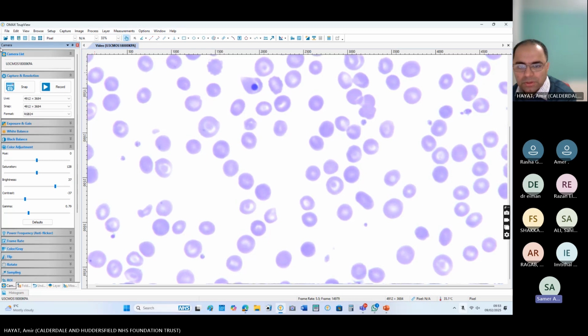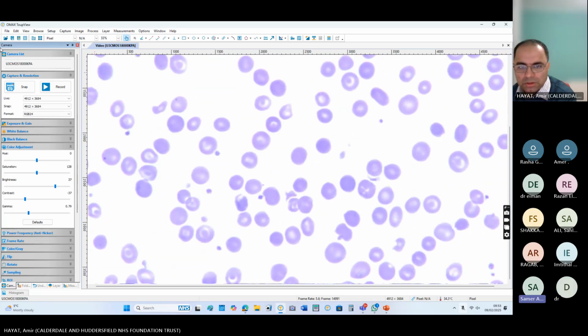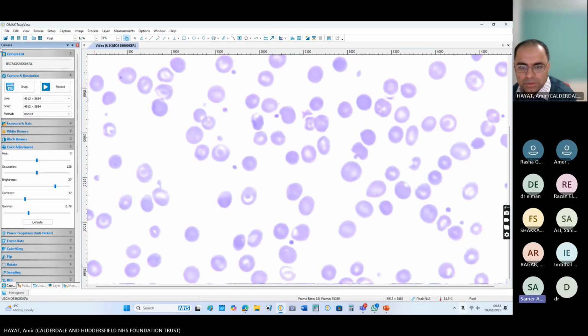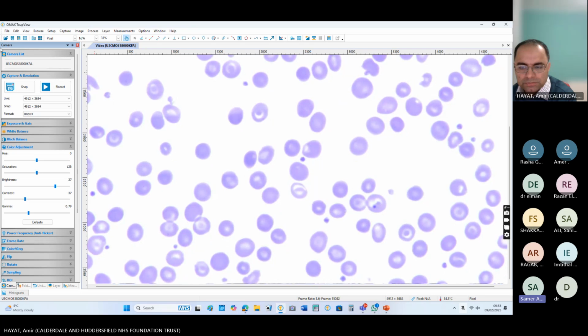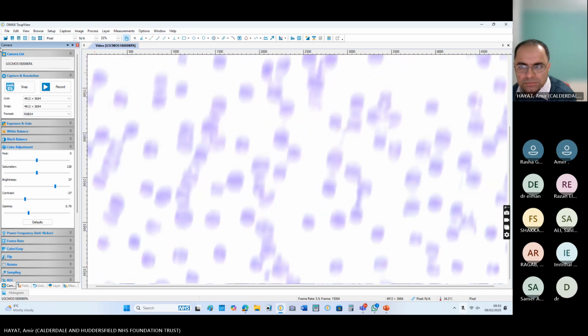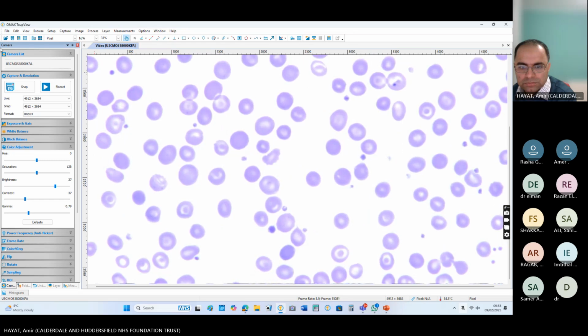Red blood cells show anisopoikilocytosis with marked target cells, spherocytes, and we could see Howell-Jolly bodies, which does correlate with possible splenectomy. What are other features of splenectomy? You mentioned Howell-Jolly body, target cell.